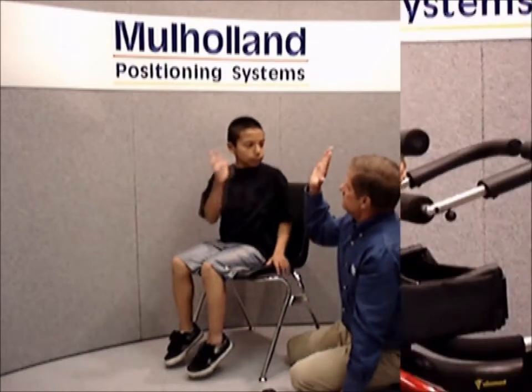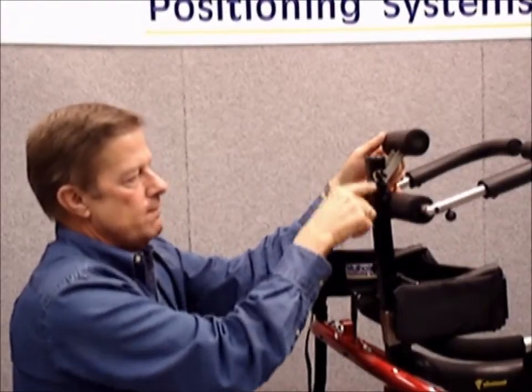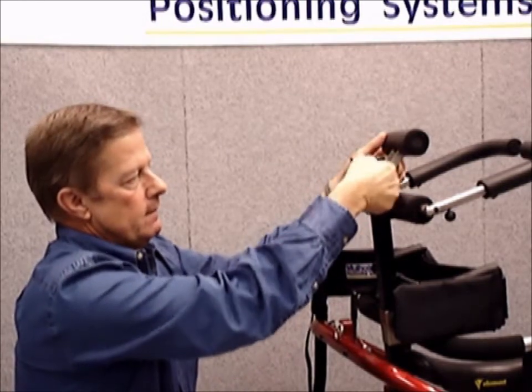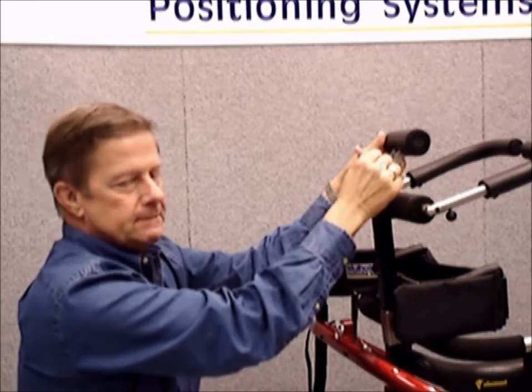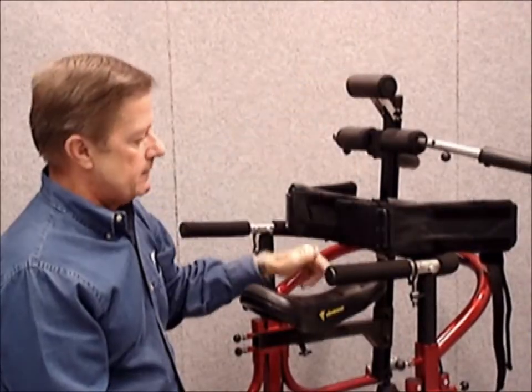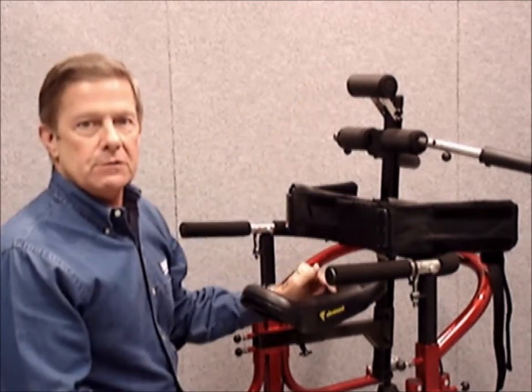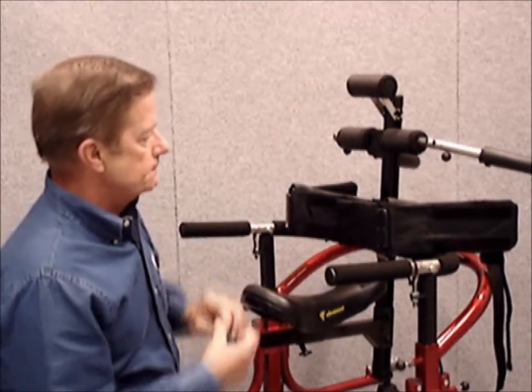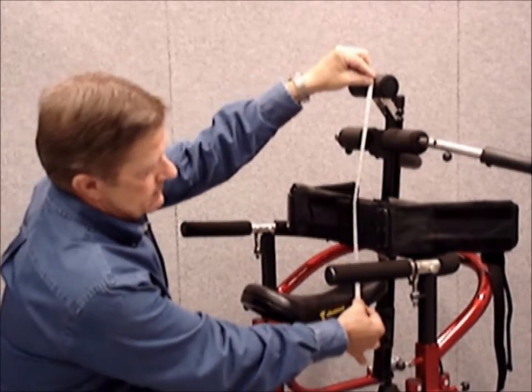Okay, buddy. To adjust the angle of the sternum pad, loosen all 4 screws. Angle your pad at a desired position and tighten. Next, adjust the distance between the sternum pad and the top of the seat. This will equal your measurement number 2 on your order form. Measure to the top of the seat.